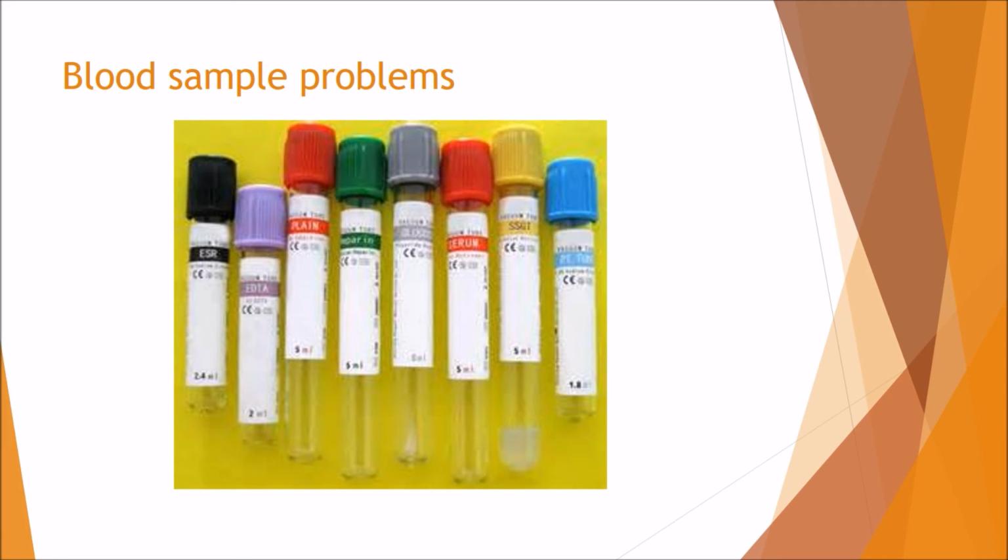So as you can see here, this red one contains serum, for example. What's used for serum?